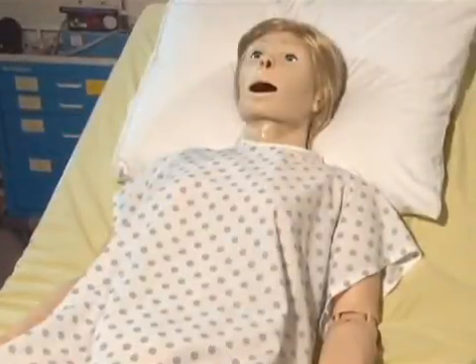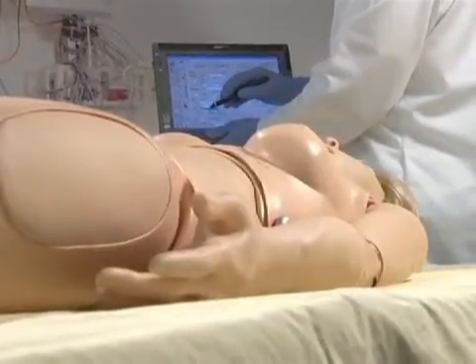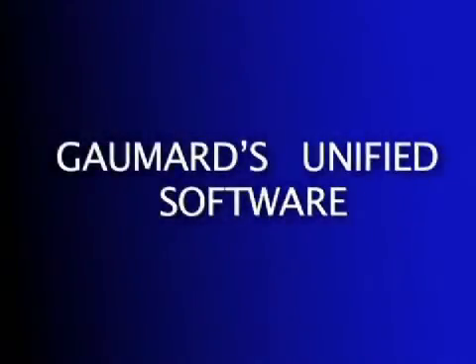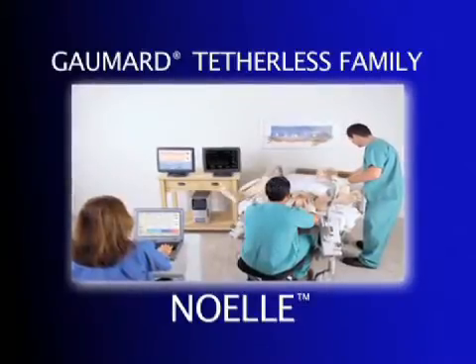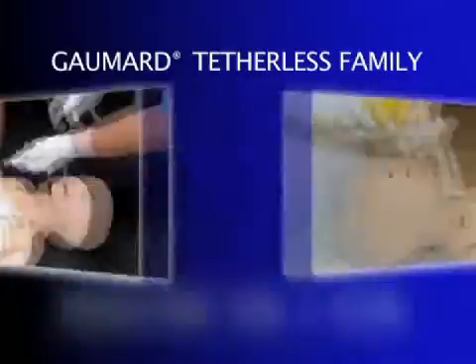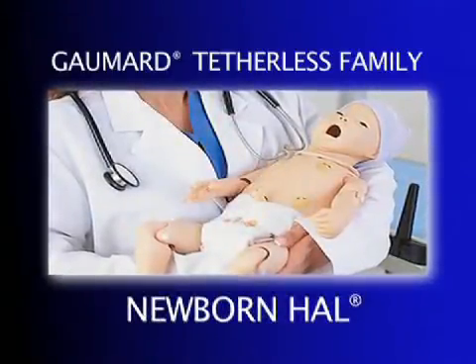SUSIE's control software is easy to use and intuitive. The tablet PC can be carried like a notebook, and the one-handed operation with the stylus adds to the portability of the system. The software framework used for SUSIE is utilized throughout the Gaumard family of high-fidelity products, meaning that once learned, the user can operate any of the simulators from the Gaumard tetherless family.